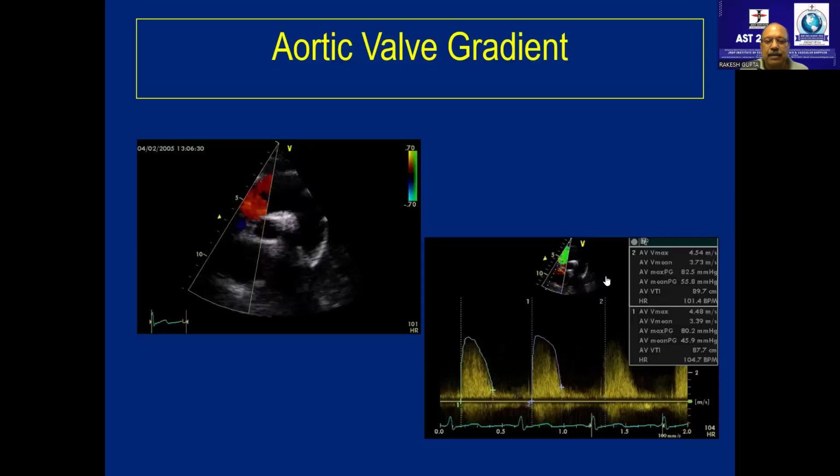Sir, explain the right anterior oblique view, the view again. The right anterior oblique view is a modification of the suprasternal window, where we keep the probe in the suprasternal window, but we keep a pillow behind the right shoulder. If you focus on my image over here, we'll be looking like this. My neck is extended to the other side, my suprasternal window is there, and my right shoulder is behind the pillow.